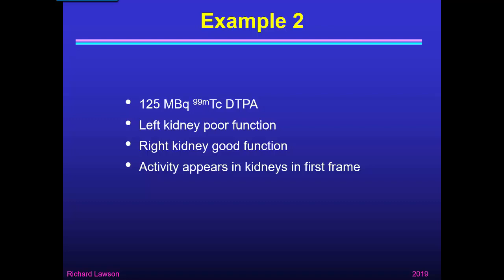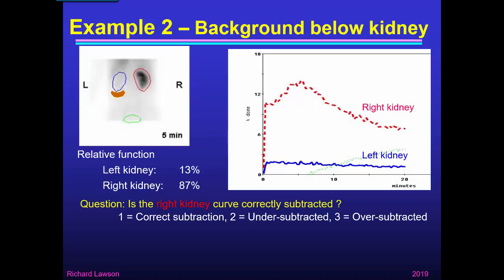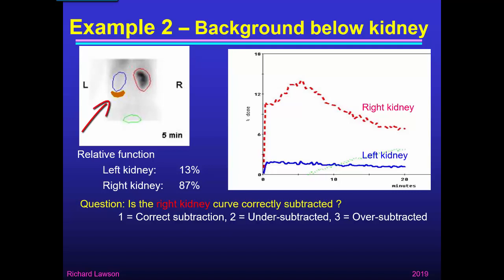This study was done with Technetium DTPA, and the patient has a left kidney with poor function and a right kidney with good function. Once again, activity appears in the kidneys in the first frame, so we don't need to worry about any delay. You can immediately see from the five-minute image that although the right kidney is well seen, the left kidney is very hard to see on this early frame.